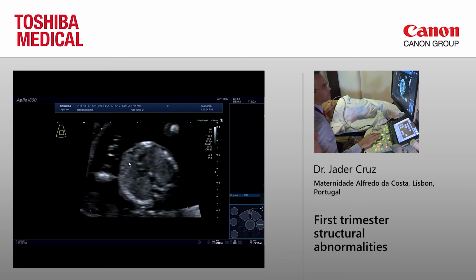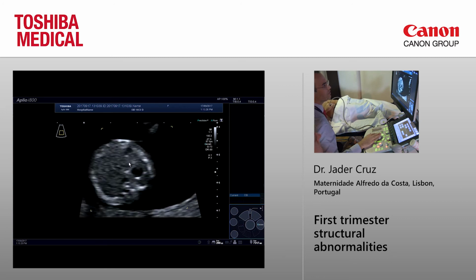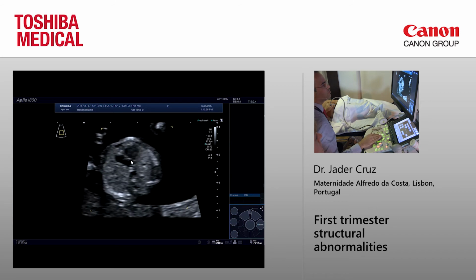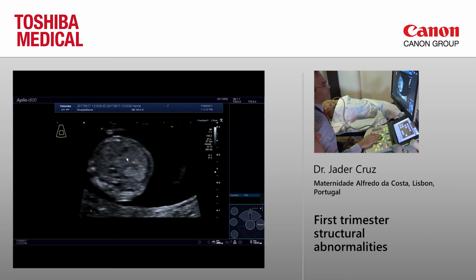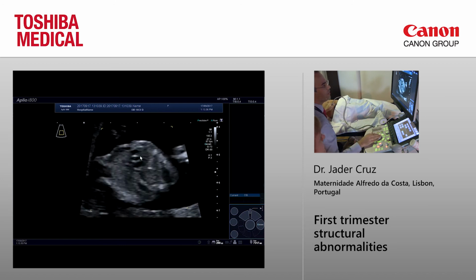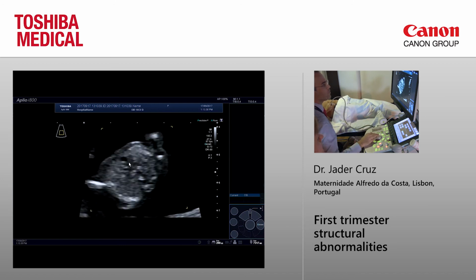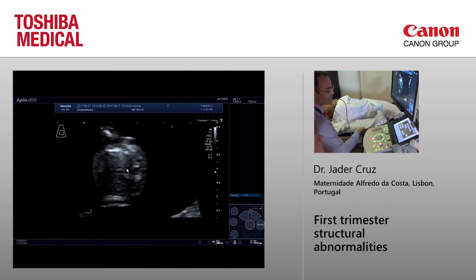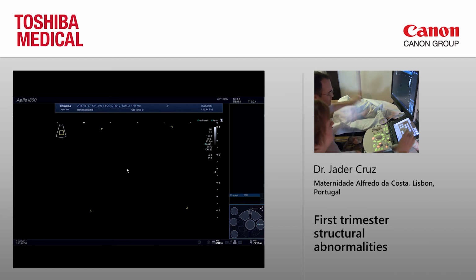Four chambers, not really in a good cross-section for you, but you have here four chambers nicely, two valves. And then the baby decided to point with the hand there. Then aorta, pulmonary artery, and the trachea. So I will try to show you with the SMI. We move to this one, yes?